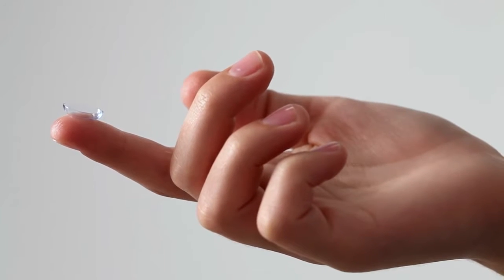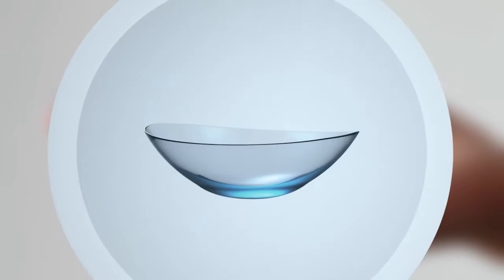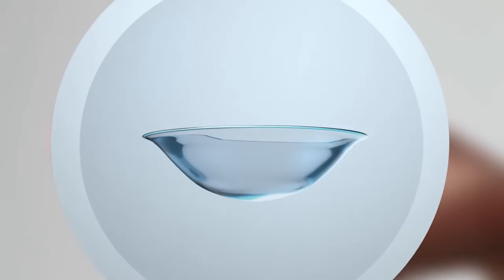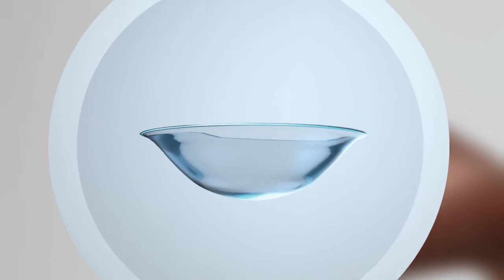Making sure your fingers are dry, put the lens on the tip and take a close look. If it's shaped like a little bowl with a nice straight edge, you're good. If the edge curves outward, it's inside out — flip it.